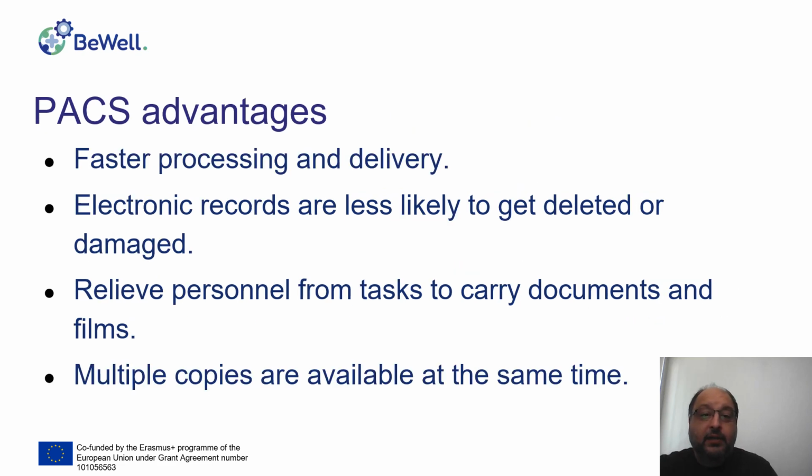So, what are the advantages? Faster processing and delivery. No need for someone to take the film to bring to the radiologist and so on, and images are almost instantly available on the radiologist's workstation. Also, in some cases, the radiologist may not even be present in the hospital and can log in from some remote point, of course, if this is configured in the system and if it is allowed by the regulations.